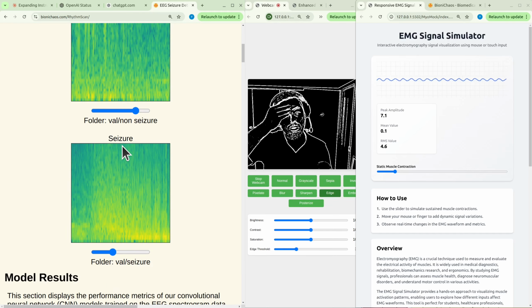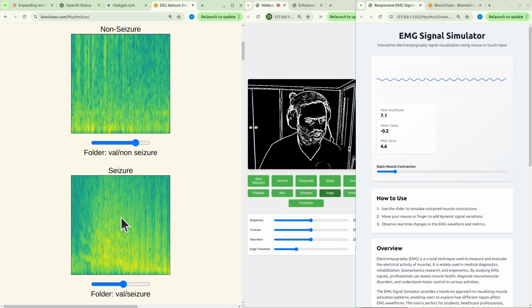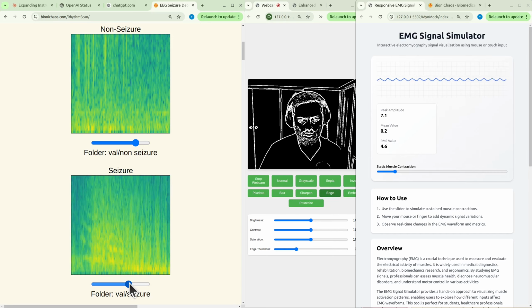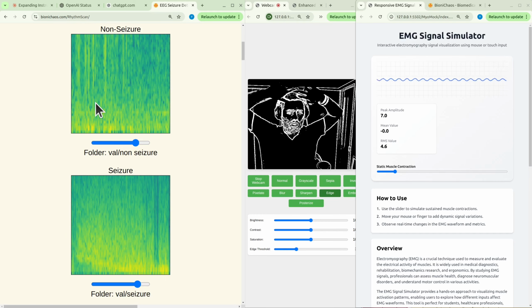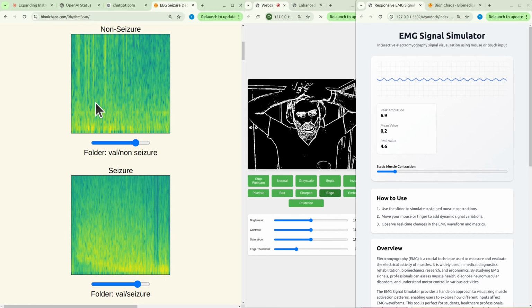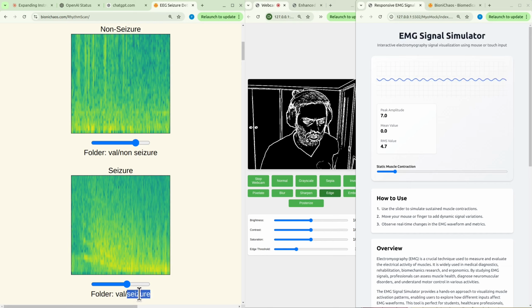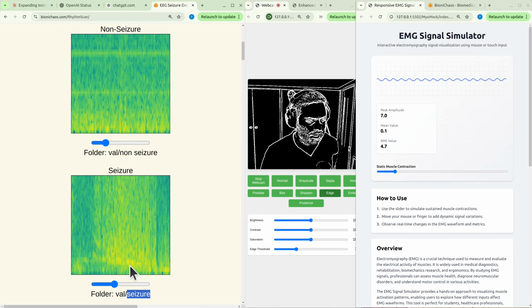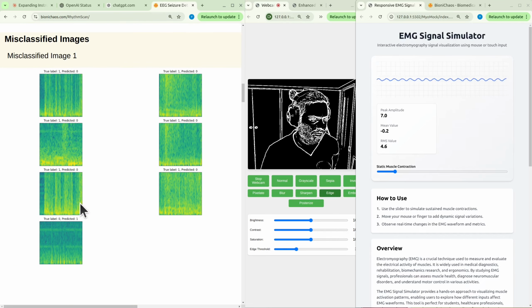And I said before, and it's worth repeating, that hopefully the convolutional neural network in this case is actually learning to distinguish this stuff. So hopefully it's learning the correct features. All the other parameters should be the same, the size of the image, the colors, things like that. The only difference should be that the seizure spectrograms have this pattern of the spiking activity. And yes, it's harder to see on some images than others. You can see from these examples where the misclassification happened, that one should have been a clear cut.